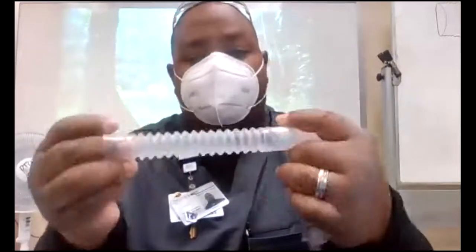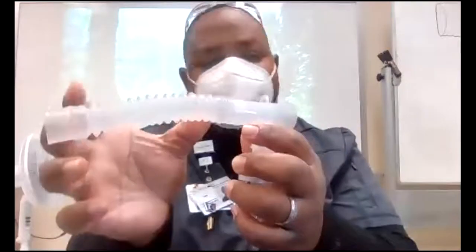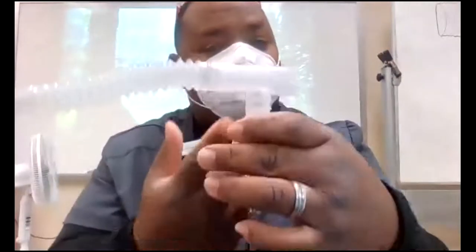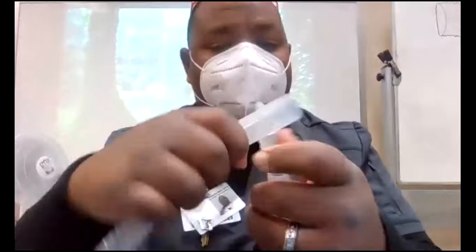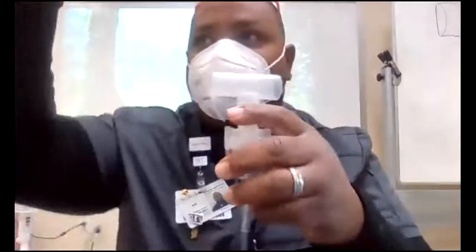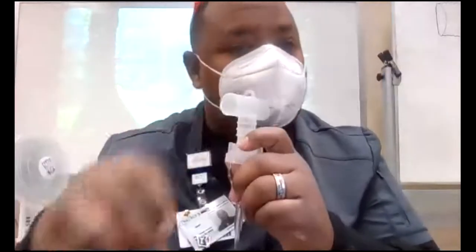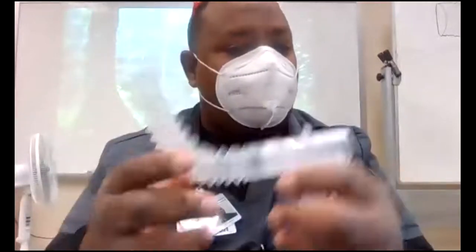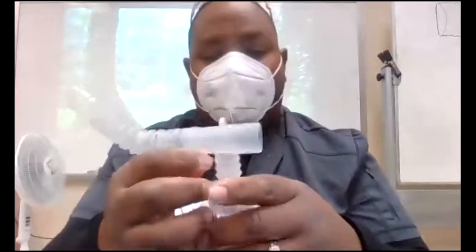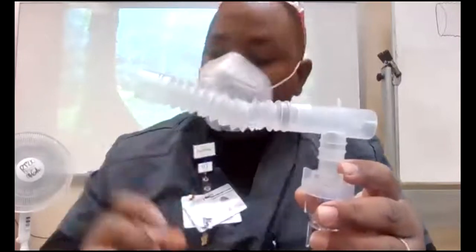The reason it's a reservoir tube is because it collects any kind of medicine in between breaths. Your little smoke or your mist will be in here, and some is coming out too, but you've got some in here. So when I inhale, I'm getting not only what's coming from the medicine cup, but what was in the reservoir tube at the same time. So I get all of that. Without the reservoir, all of my extra medicine would be coming out and lost. So we have a little something on here to help collect it and hold the medicine in here. This is the reservoir tubing.